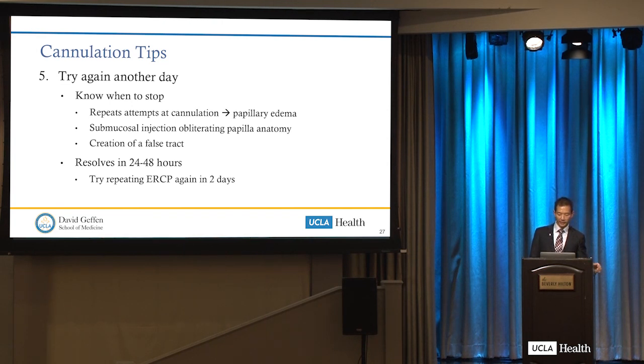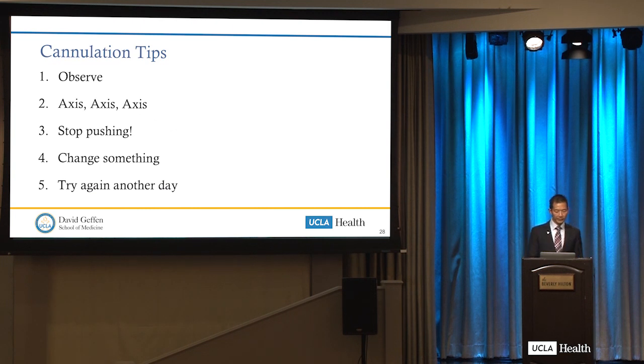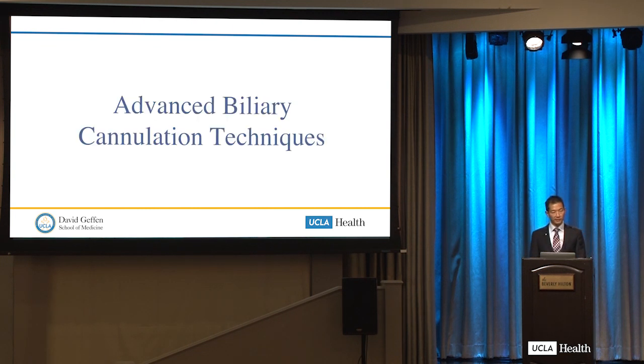All right, so there are my cannulation tips. We're going to move to advanced biliary cannulation techniques, some of which you may be familiar with. Some of you are very good at this. Others may feel very uncomfortable with some of these techniques. But let's just go over a few of them.